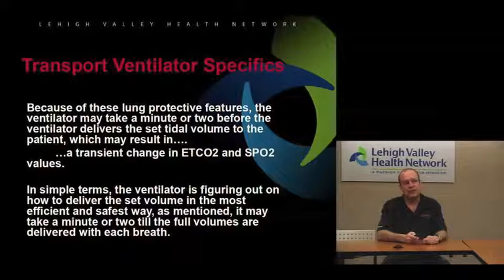So now that's going to be another case where your end tidal is going to start to rise and your sat's going to go down, even though the machine's trying to deliver a full breath, but it won't because it comes within 10 of your high pressure alarm. So just a word of warning, if your patient has some relatively high airway pressures, or even when you're moving the patient around, or maybe the patient's coughing a little bit here and there, you might want to widen out your alarms a little bit. The alarms are pretty sensitive on the Hamilton T1s, so it's just something you need to be aware of.